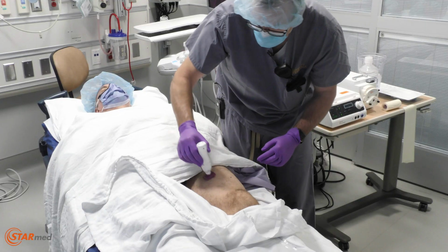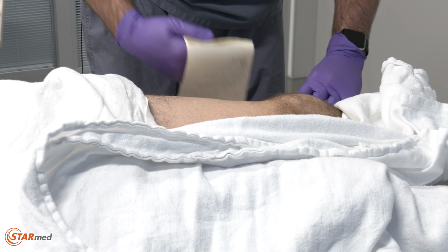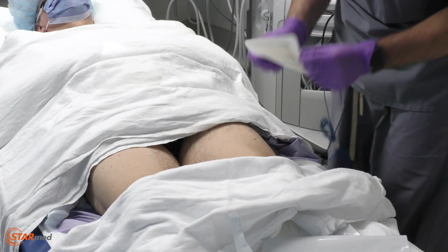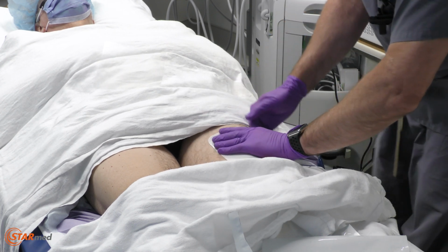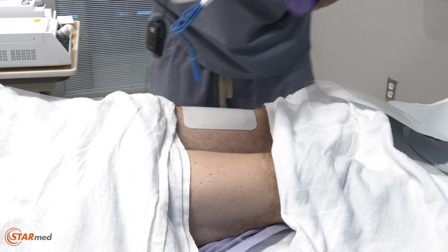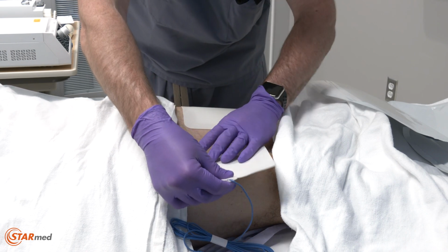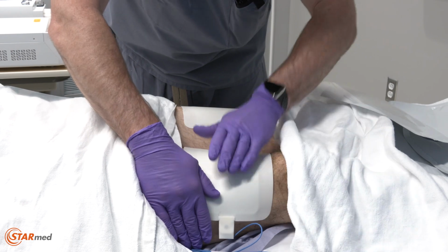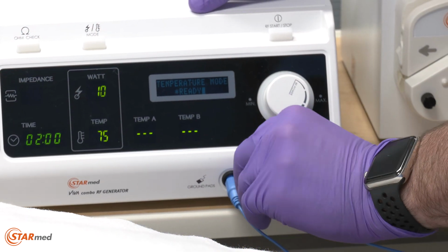For proper placement, shaving a patient's thighs may be required. We're going to go ahead and take all this off, and we're going to put these grounding pads on, okay? This is a good time to confirm that the grounding pads are lying flat and horizontally on the patient's thighs with no air bubbles. Be sure that the grounding pad cables are placed on the lateral sides to avoid any interference. Each grounding pad should be equally distant from the treatment area. Both grounding pads are plugged into the generator in the same manner.